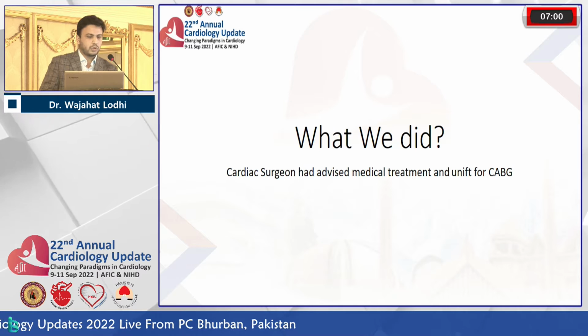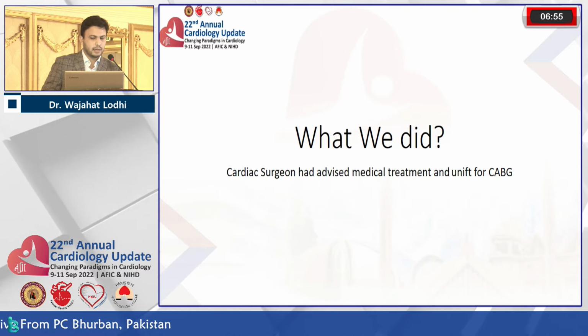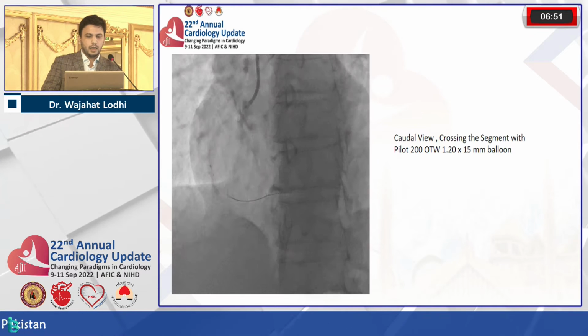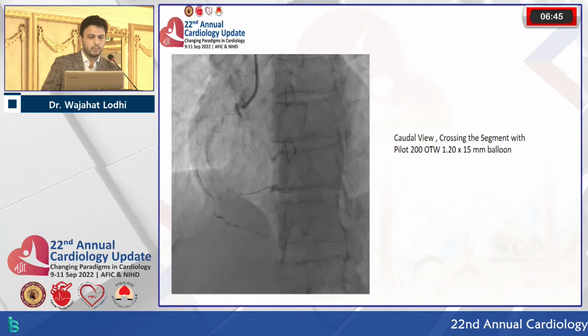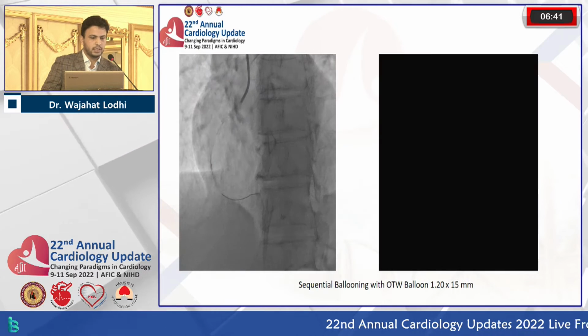So what we did, we sought cardiac surgical opinion, and the cardiac surgeon at that time advised medical treatment and deemed her unfit for CABG considering her frailty. So we proceeded with opening the CTO first. This is a caudal view. We crossed with an over-the-wire balloon using the Pilot 200, and we were successful in crossing the lesion.